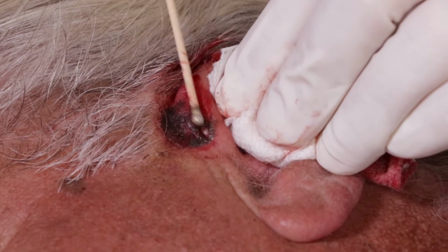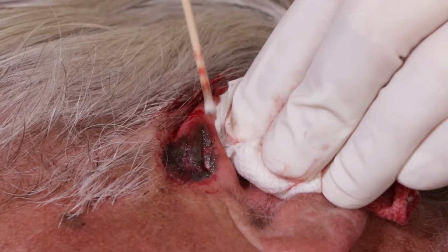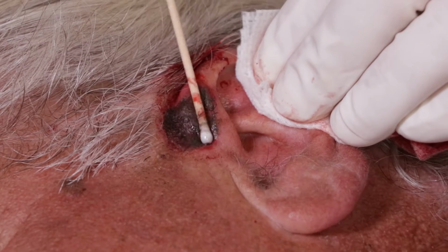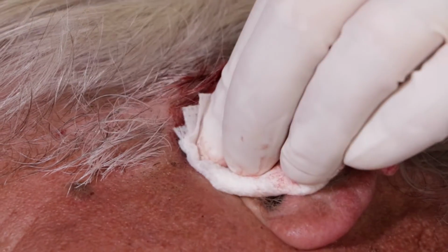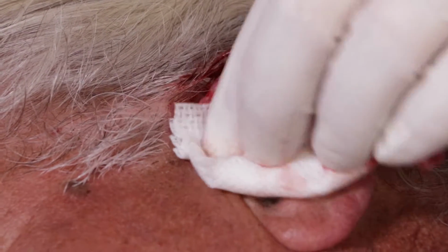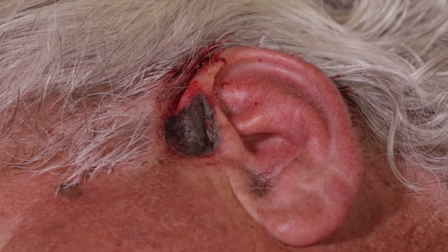I'm going to go around it, but not go inside of that cut. Just roll over it on both sides. We're just going to let that close over. I'm not going to put any stitches or anything, just let that close. Thanks, Jerry. We're going to have to keep a really close eye on that because that actually was open and I can see your cartilage. That's not the way it's supposed to happen, but it's going to heal.